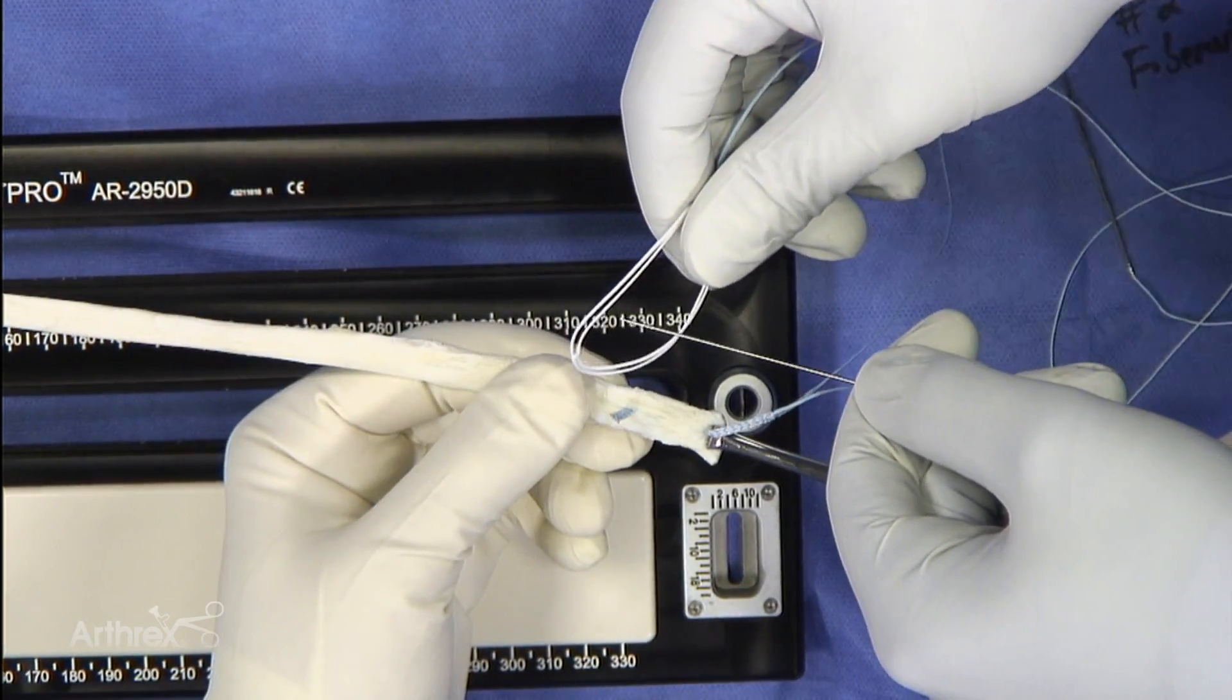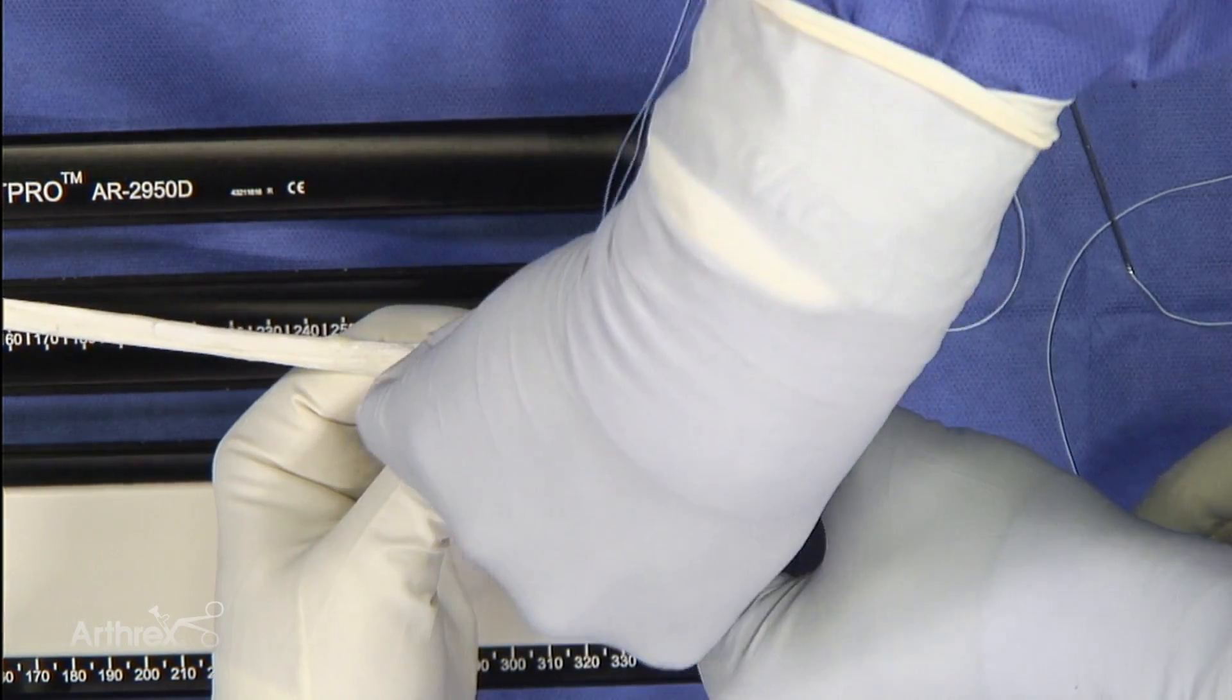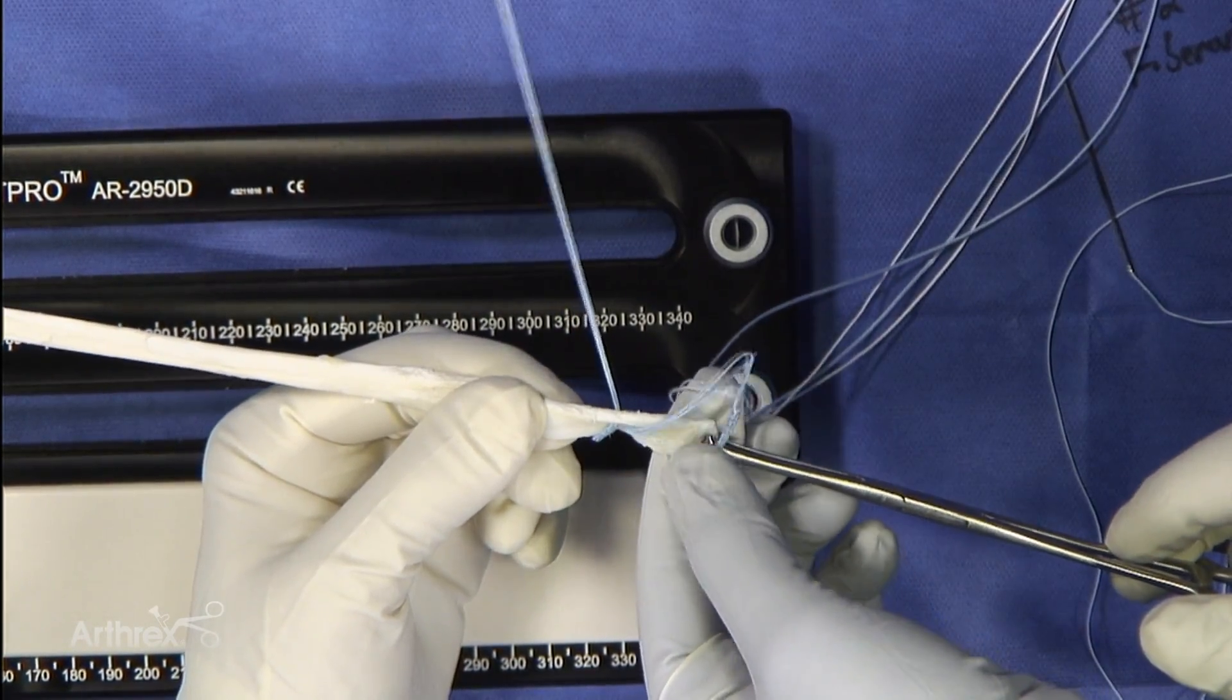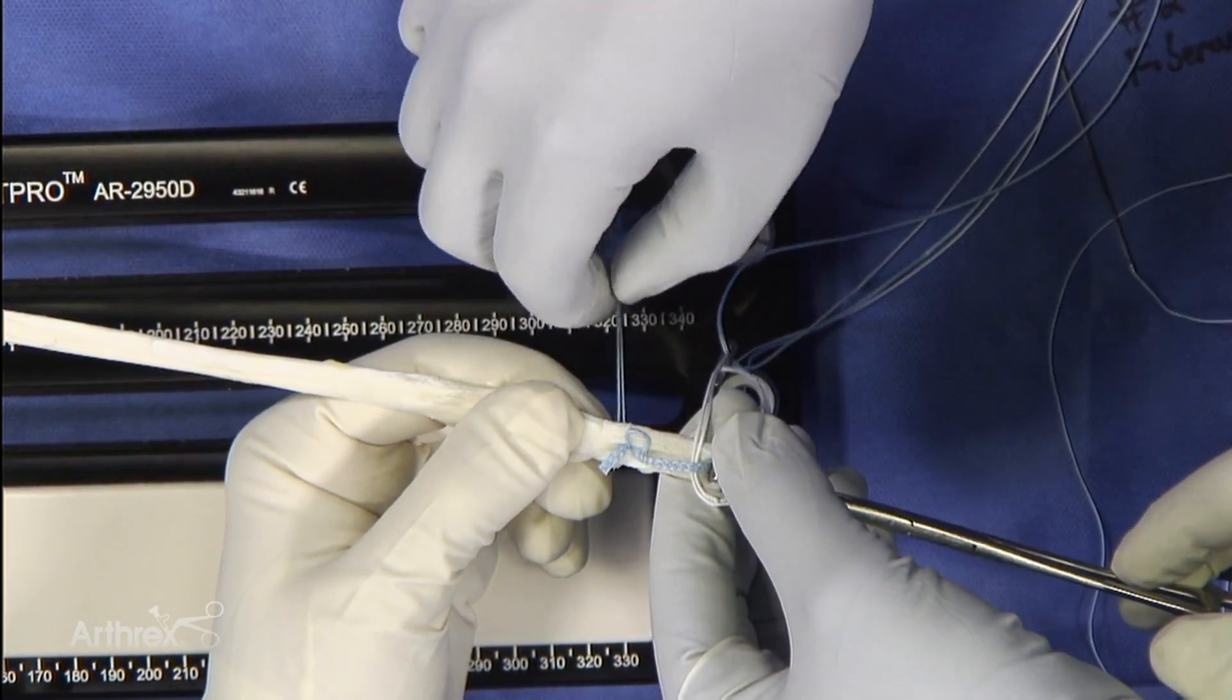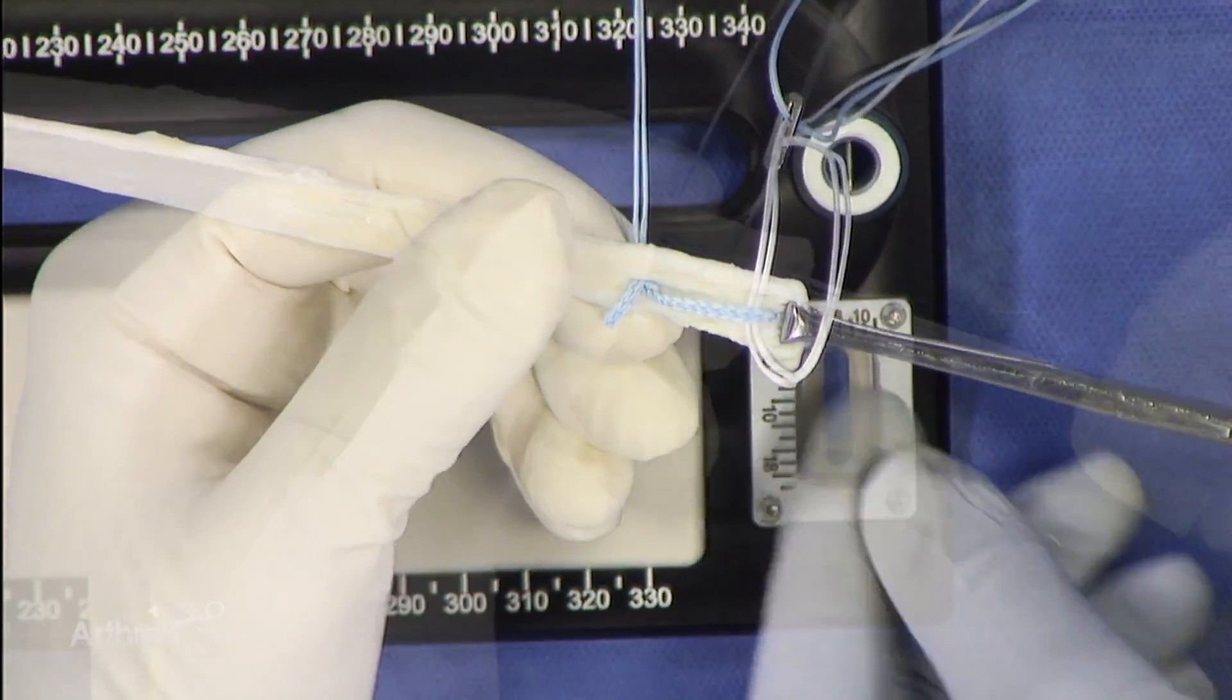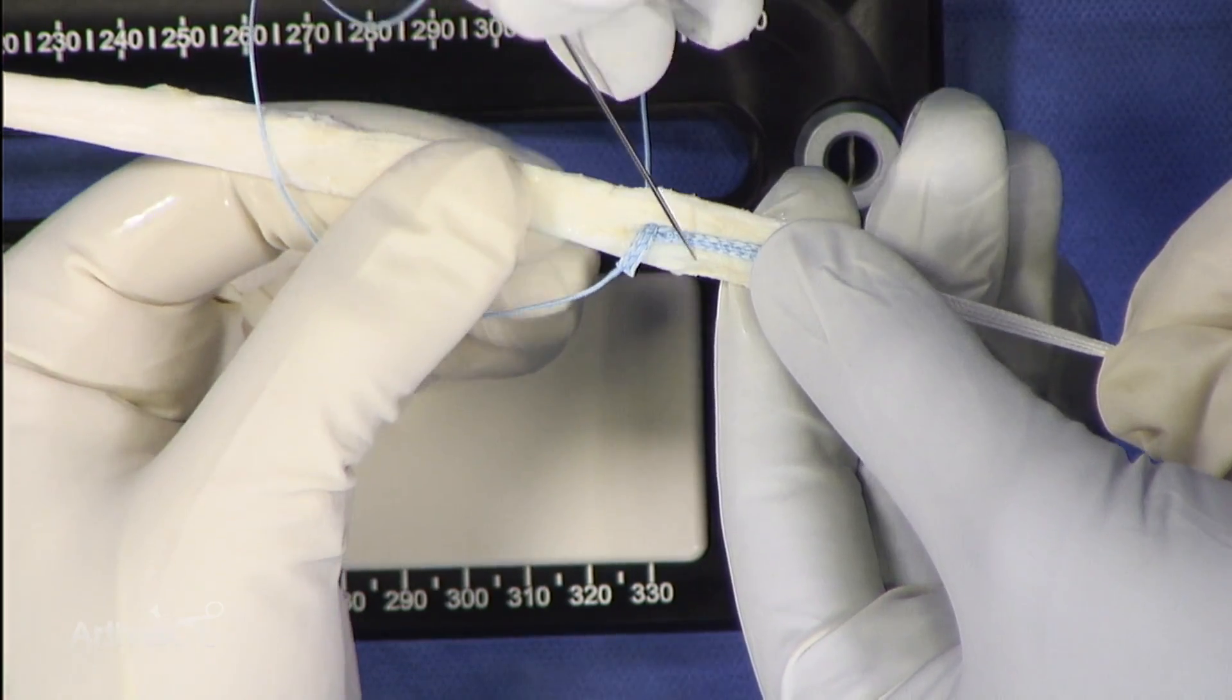Now we're going to loop the fiber tag sutures through the tightrope RT, and we're going to grab both the graft and the actual fiber tag with the needle. That's going to help secure it. And biomechanically, this has been tested to be very strong.